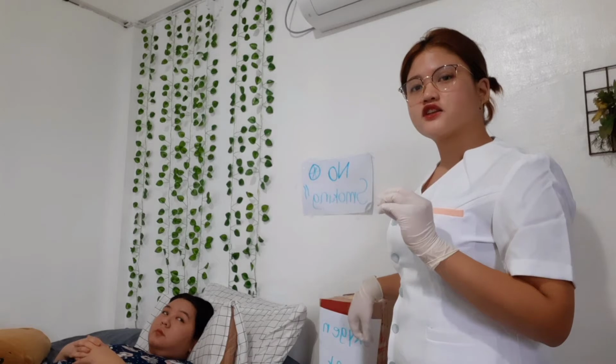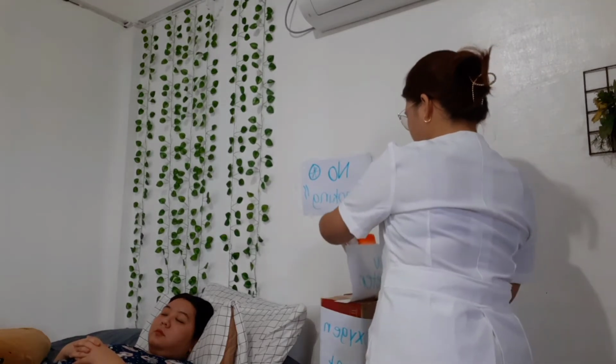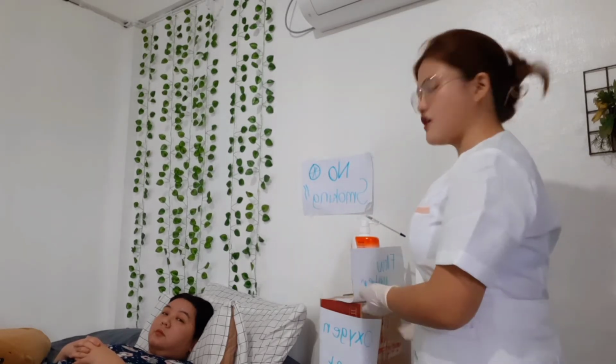So next is attach the humidifier to the base of the flow meter. So you need to fill the humidifier bottle with distilled water. So the rationale for that is the oxygen is forced through a water reservoir to be humidified before it is delivered to the patient. So it will prevent dehydration of mucous membrane. So as I said earlier, it should be in off position. But I use this one because this is just an improvised humidifier and oxygen tank.